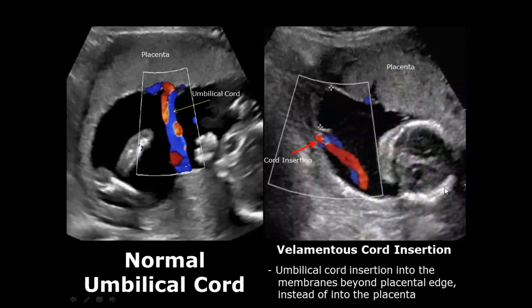In this image, the umbilical cord is inserting into the membranes and here is the placenta — this is also a velamentous cord insertion.